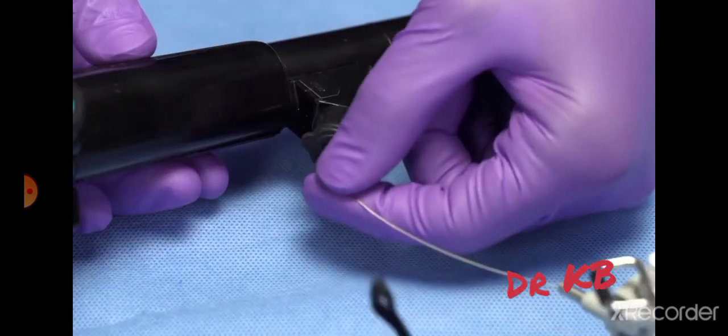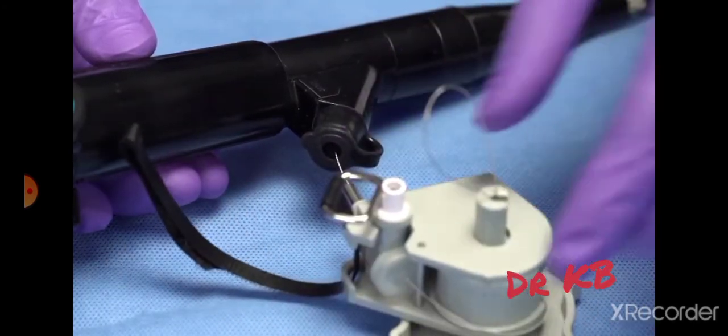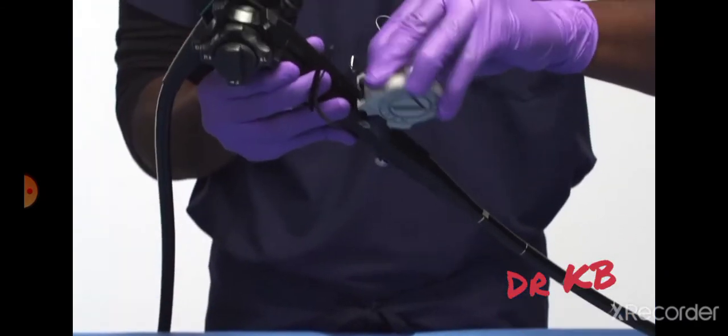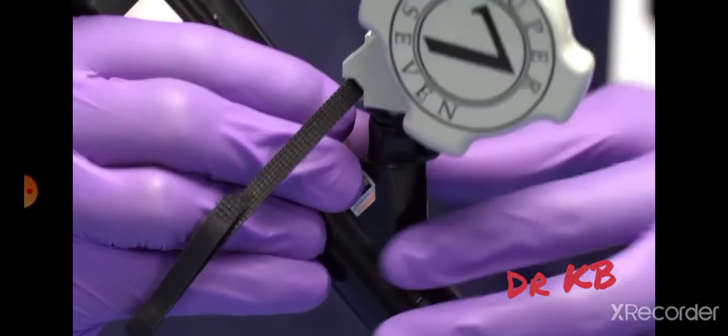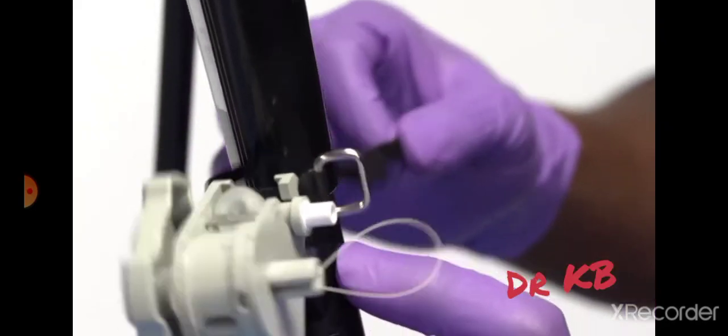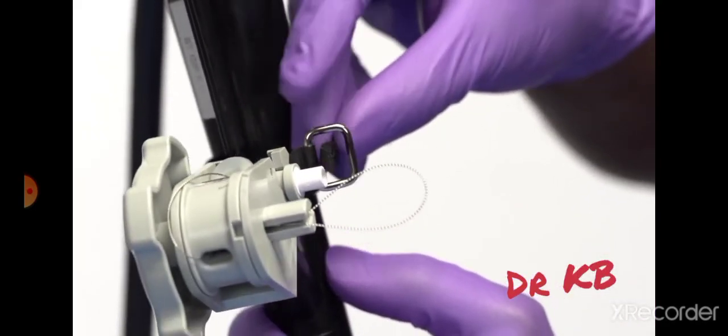Firmly insert the handle unit into the biopsy valve onto the stem of the handle unit. Install the handle unit into the biopsy opening of the endoscope. Secure the handle to the endoscope with the strap.